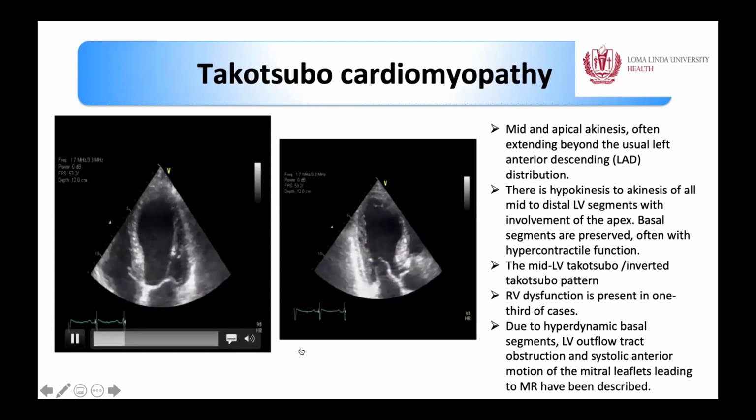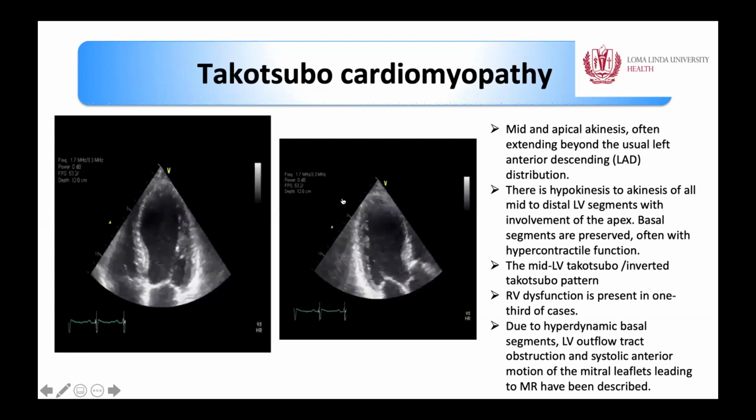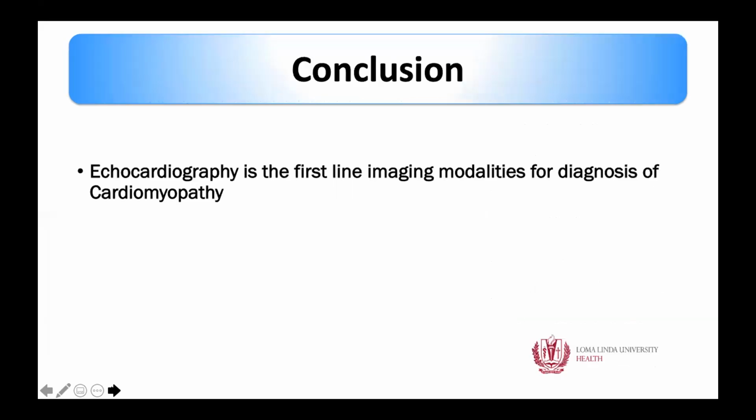Just like an anterior MI can sometimes lead to this pattern, identify why the SAM is happening and what the wall motion abnormality is. So I think that is my last slide. The conclusion is that echocardiography is definitely the first line imaging modality for diagnosis of cardiomyopathy, but we should be aware of the strengths and weaknesses of every imaging modality and use it to the advantage of our patients to make the correct diagnosis and offer them the right treatment.